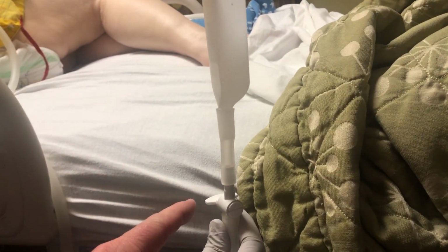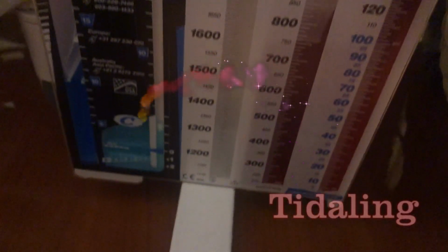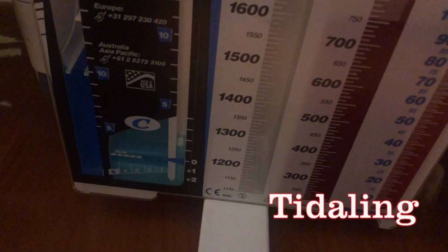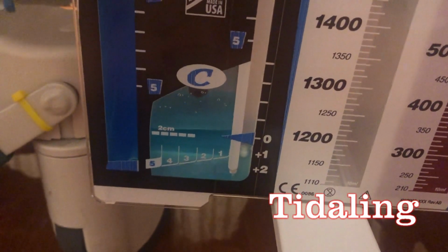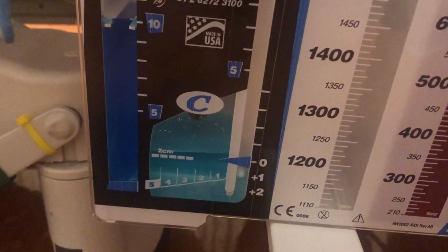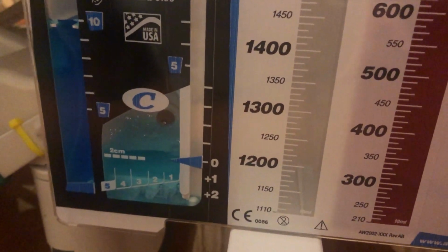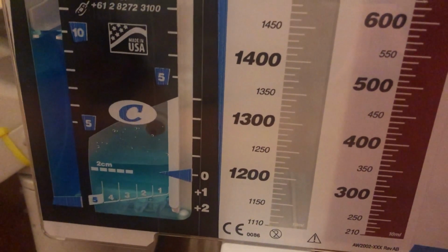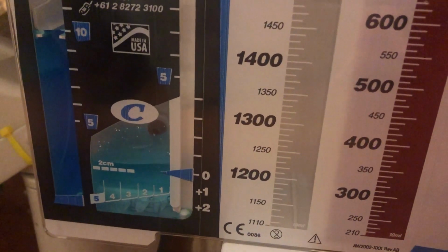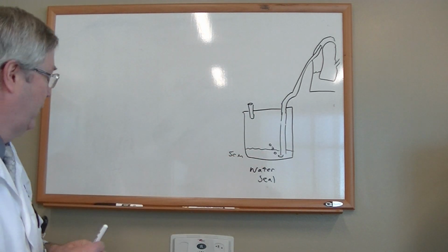When we're filling it, we fill this tube up to capacity down to that valve. Then when it's up to the mark, we can open that valve, and that'll drop it into the chamber, and that sets this one, which is the water seal. Now you can see that the ball is rising and falling. We call that tidaling. It happens with each breath. So this is the air coming from the patient. And when that's all done, then it should be tidaling again. It doesn't let any of the contaminants of the world in. They're blocked by this puddle of water.